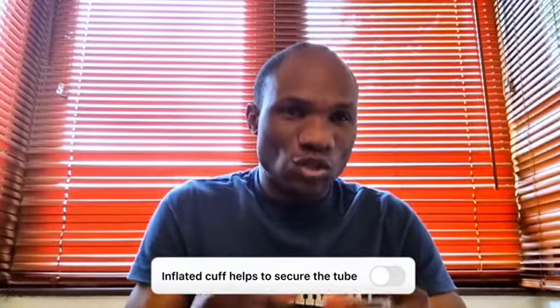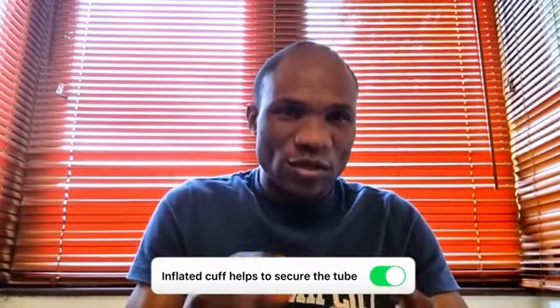cause easy displacement or dislodgement of the tube, because if the cuff is inflated, it also helps to secure the tube. So if it is underinflated, the tube can easily get dislodged from the patient, and then that's an emergency, because you have to look for other alternatives to secure the airway for the patient. So it's important that we take the measurement of the cuff pressure in the patient.